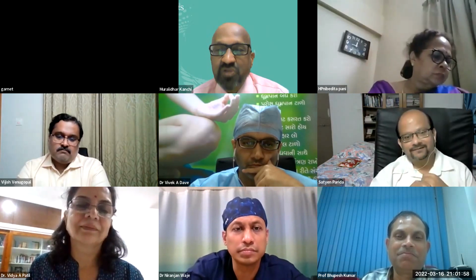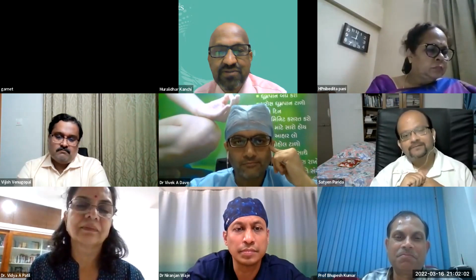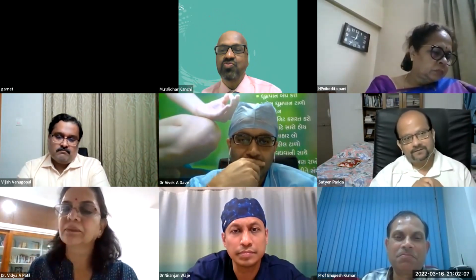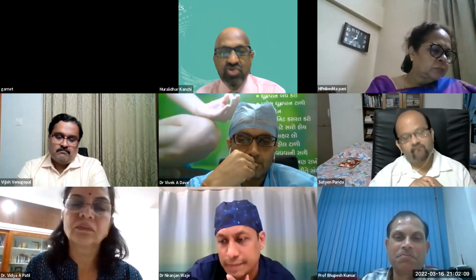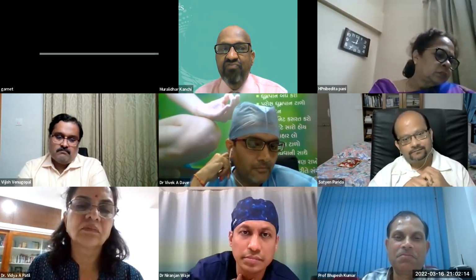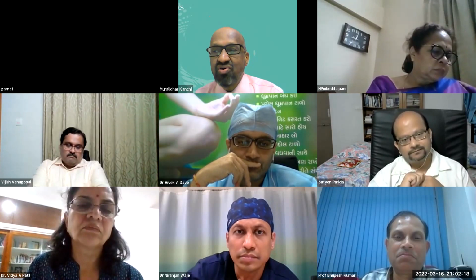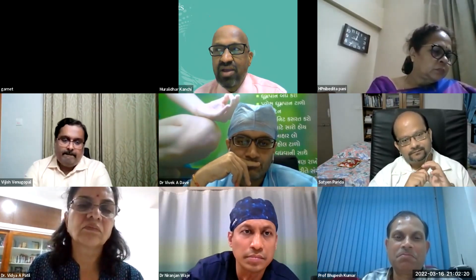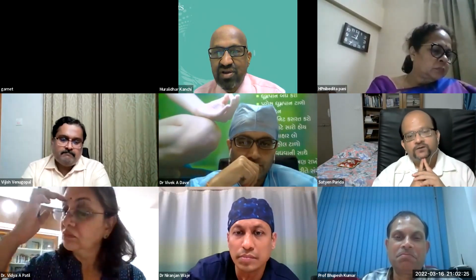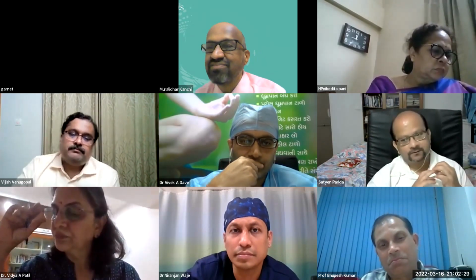You mentioned prospective studies. What we should do is use the HPI, that is the hypotension prediction index, when we are tapering inotropes in intensive care units. The best advantage is whether we can fairly quickly turn down the inotropes or not. We should know by looking at the hypotension prediction index. It has not been studied so much in the ICU. That is one area which has not been explored.